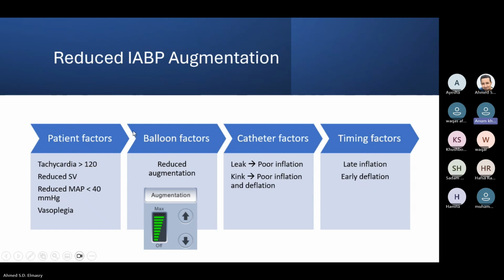Yeah, I saw one or two hospitals that were also weaning by augmentation, but maybe because of the precautions they have to take, like they cannot reduce lower than 60, and they have to go for a certain level of augmentation, they have to take care. That's why maybe most of the people are not preferring to wean off by the augmentation. And according to some hospitals, the ratio is safe.